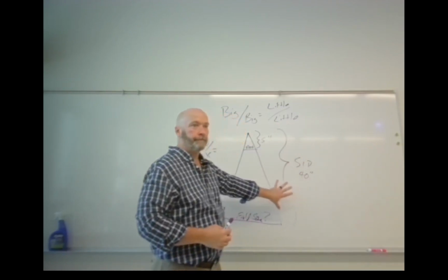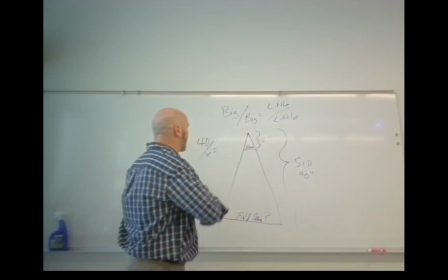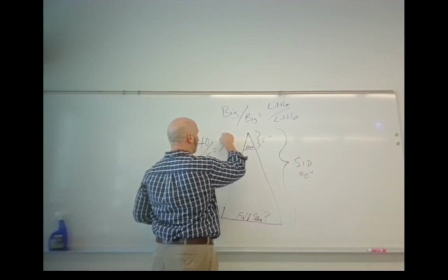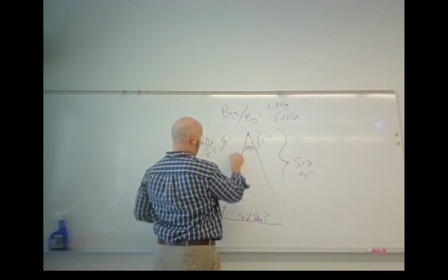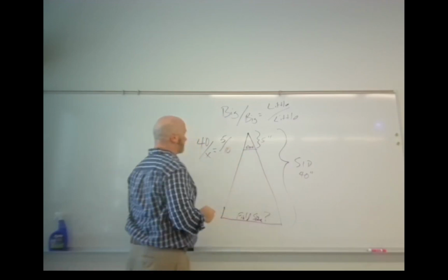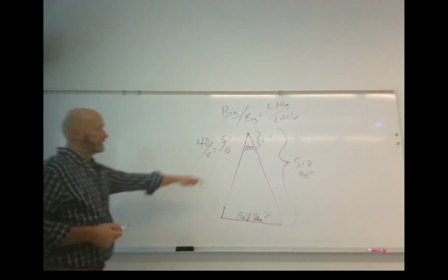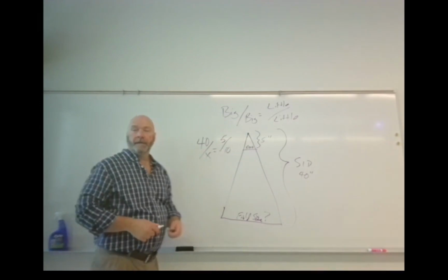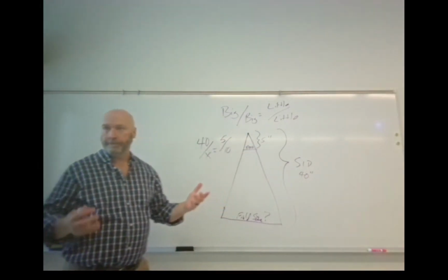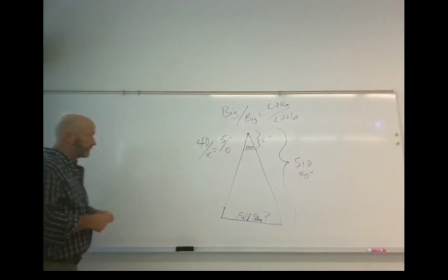The 5 inches. Yeah, the 5 inches. So we've got 5 over 10. Where are you pulling the 10 from? The 10 by 4. Okay. So sometimes these problems will give you a circular diaphragm opening, sometimes it'll be, excuse me, rectangular.